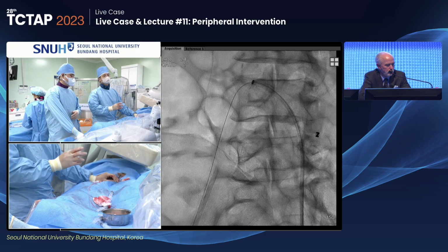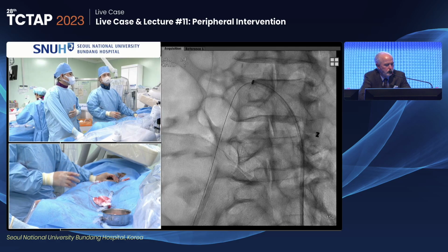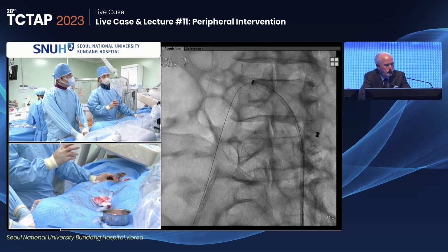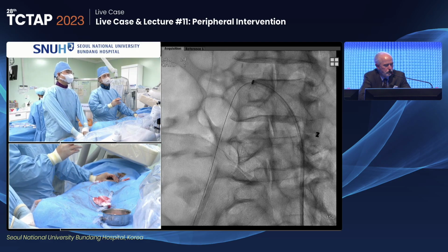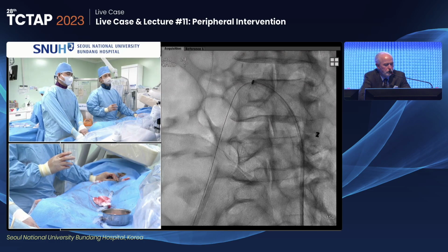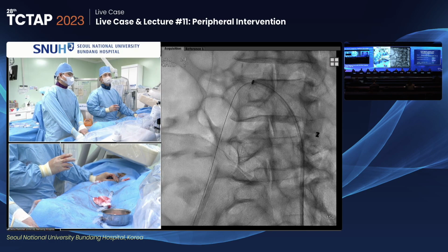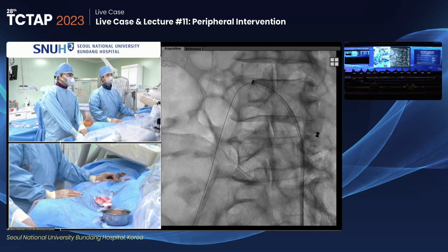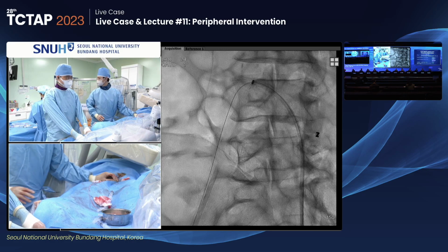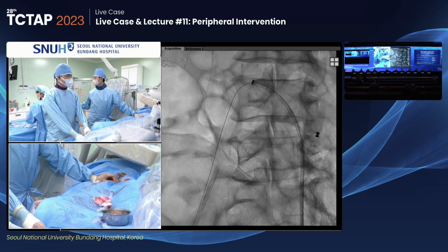I hope the internal iliac artery can be saved. But after bigger balloon angioplasty, if the internal iliac artery ostium is jailed, that can be dangerous, and maybe I can rewire retrogradely to the proximal part. That's my strategy. JR4, the catheter that came out earlier.